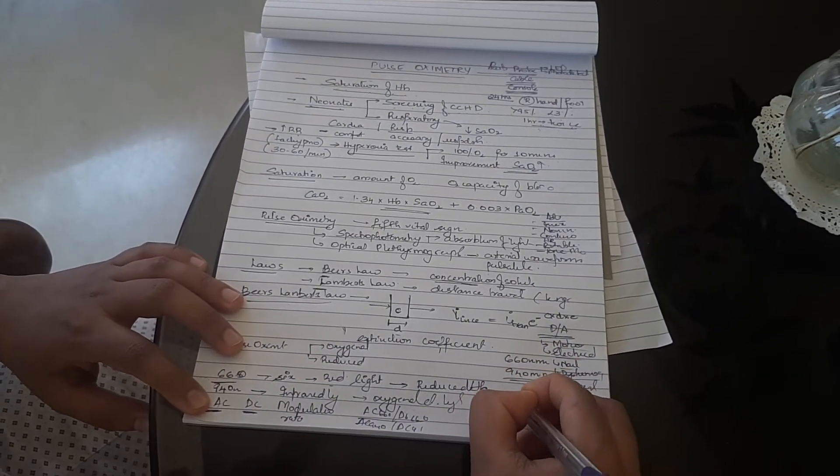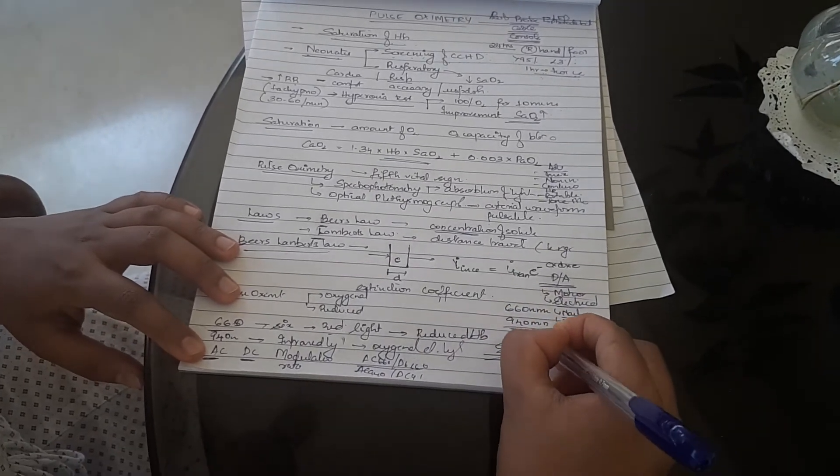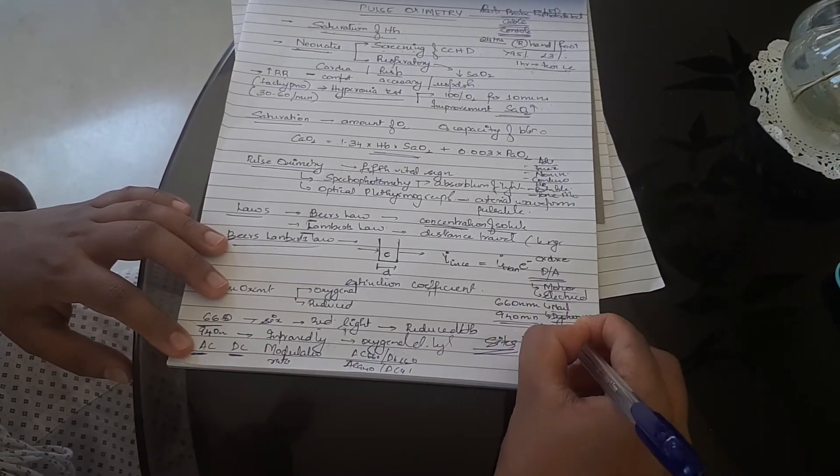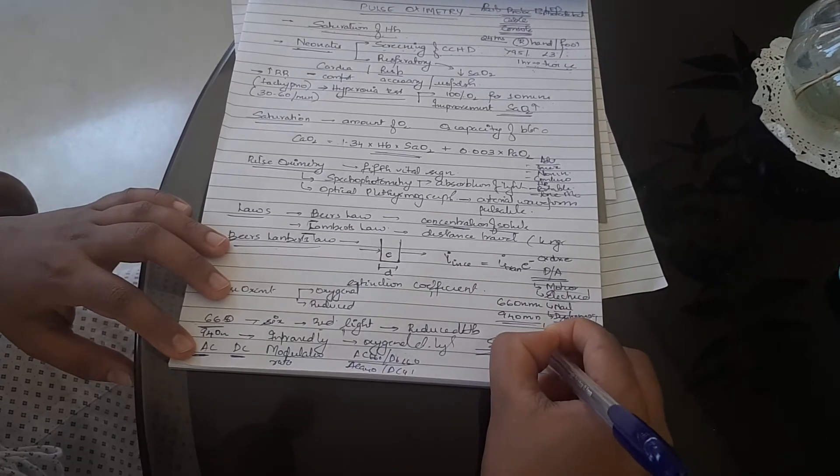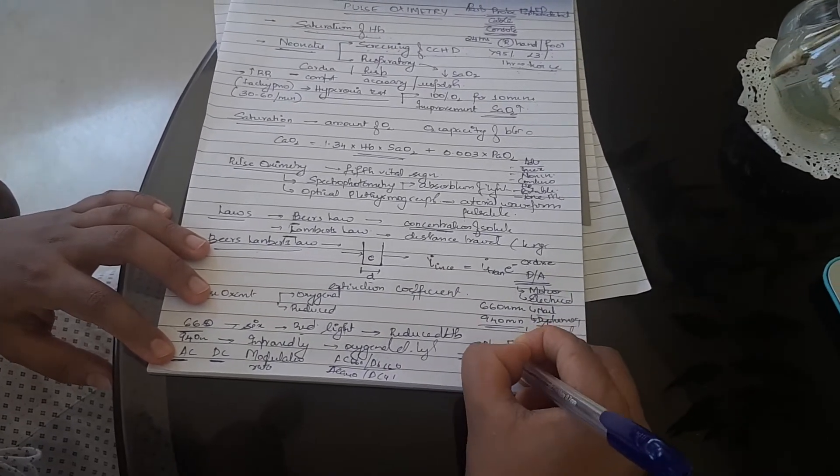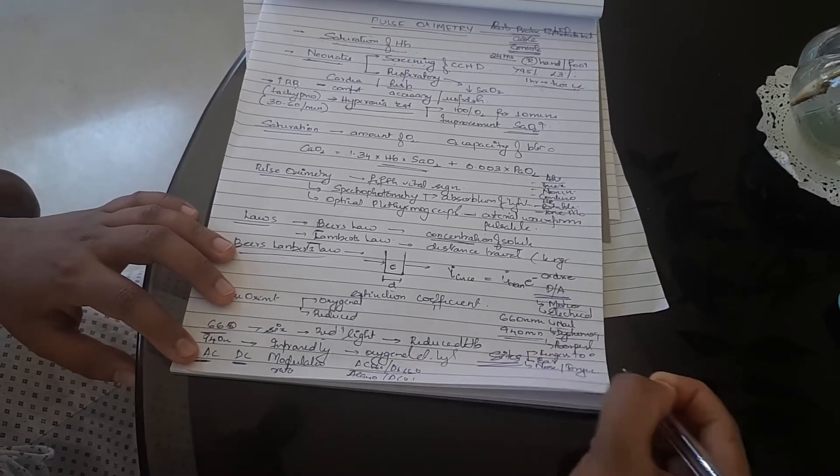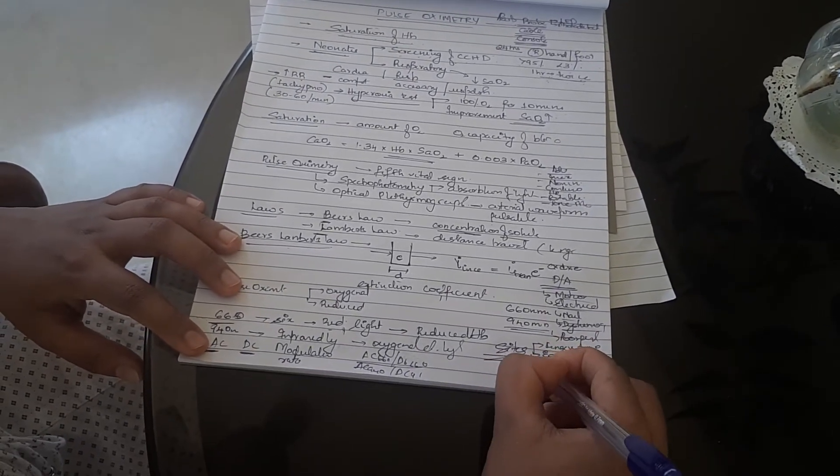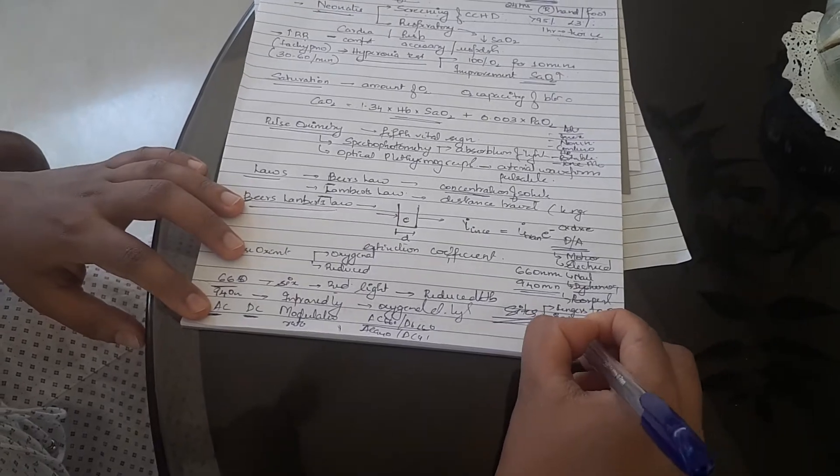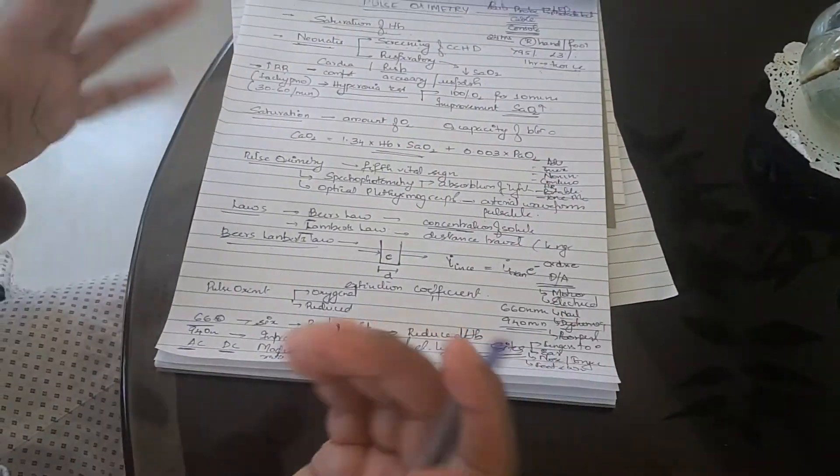Next, sites where you can apply this. Most commonly in adults we use fingers and toes. You can even use the ear. For pediatric population, we can use the nose, the tongue. And we use the foot and wrist for neonates because their fingers are so small.